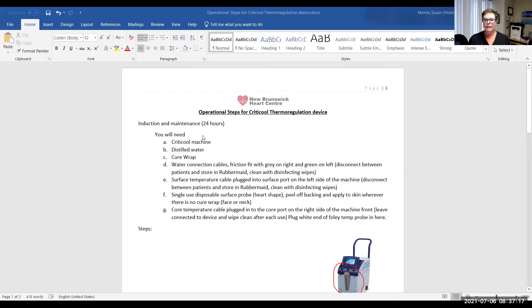So what you will need is a CritiCool machine, some distilled water, the cure wrap, which is in the blue bag, the water connection cable. So those are the blue connection cables. You will need a surface temperature probe. That is this one here that looks like a heart that will connect into the cable that has a green end on it. And you will need your Foley catheter to connect to the core temperature probe, which is gray.